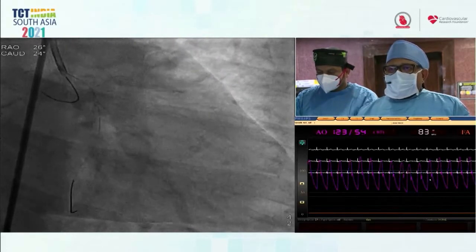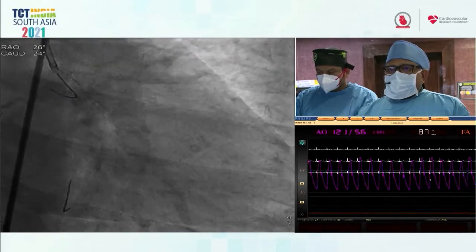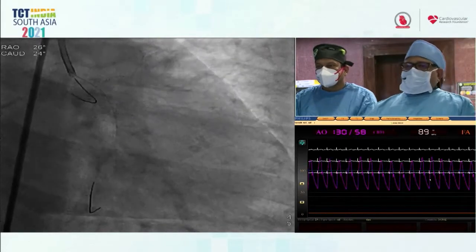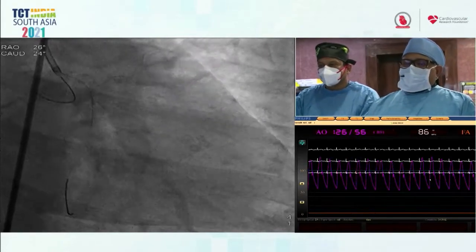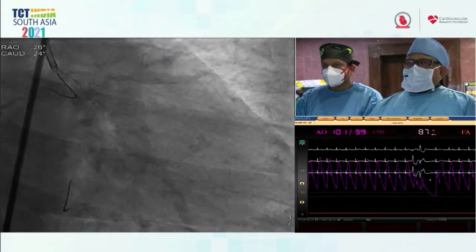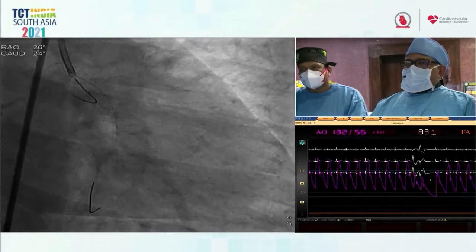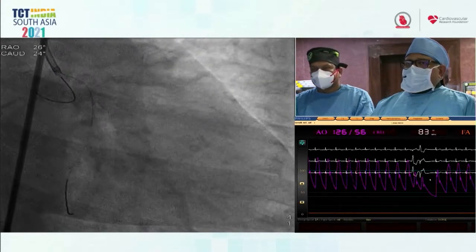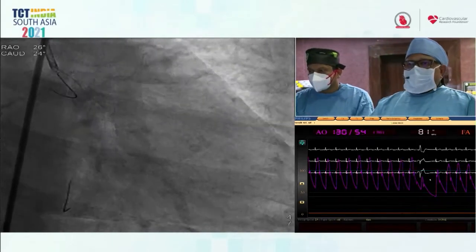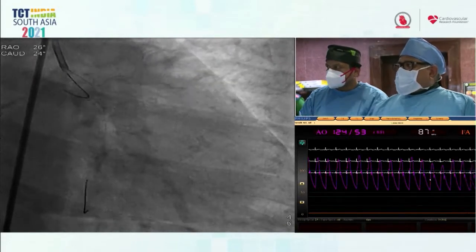If you have less than 50% plaque burden and a lumen area more than 4 (it was actually 3.5 and 50% in the paper, but for easy remembering, 50% and 4), then the likelihood of jailing the circumflex and having an FFR less than 0.8 after single stent crossover is very low. And so you protect the circumflex, and then you stent from the LAD to the left main.